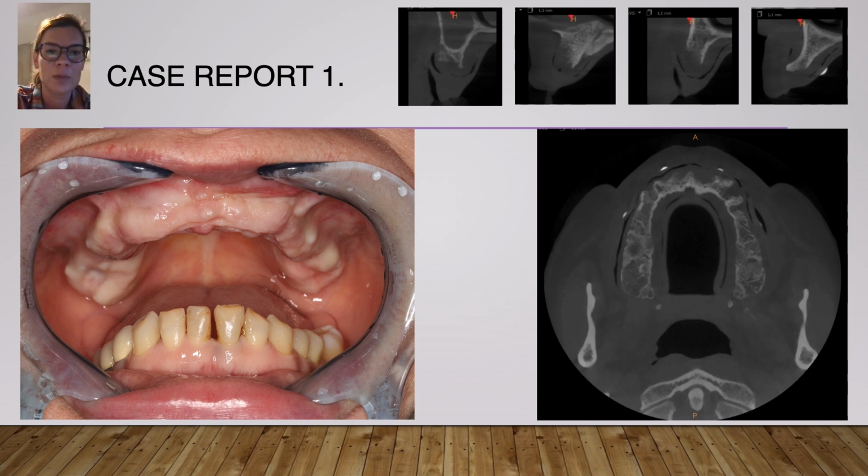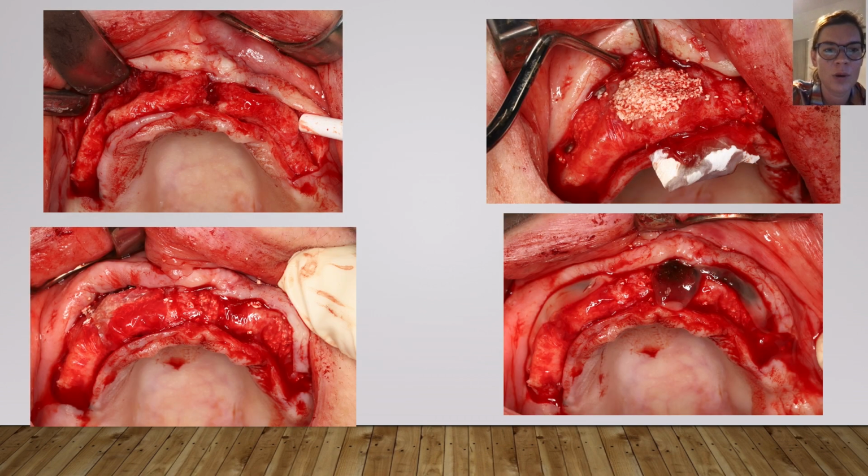I could see that the patient wanted a fixed implant-supported restoration, not removable. And as you can see, in the key positions the healing was not good. There are big bone defects everywhere, in the vertical dimension and in the horizontal dimension. So I decided to make a big lateral and vertical bone augmentation first, and afterwards place the implants. When I made a quite big flap, you could see the insufficient healing, and that there are a lot of defects everywhere in the jaw.